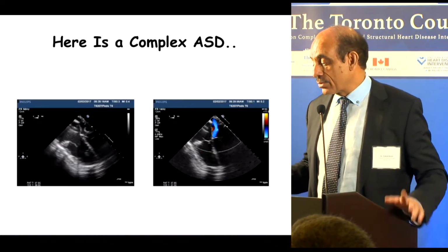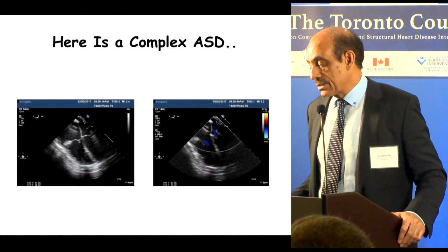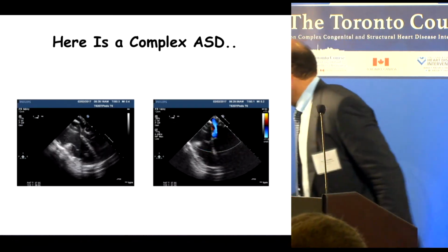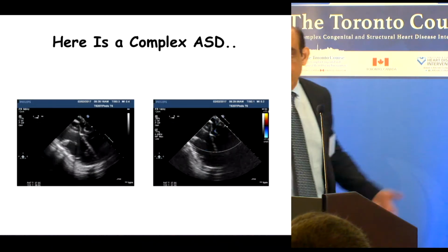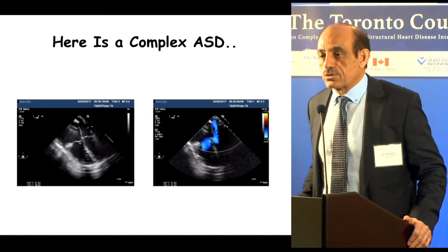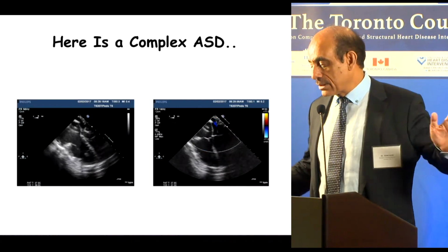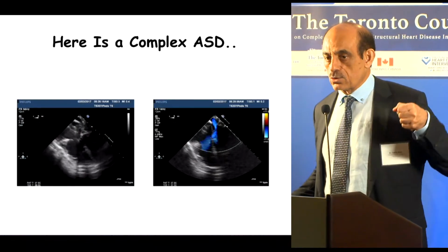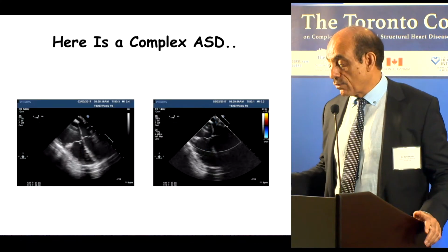So I'll run through this without explaining. This patient is about 12 kilograms. If you look at the pie, that pie will tell you if it's a short axis view, a bicaval view, or a 4-chamber. So 0 to 20 degrees will always be a 4-chamber view, no matter what you do, unless your transducer or the probe is too deep or too superficial. So at 0 degrees it's a 4-chamber view, and you see all 4 chambers.